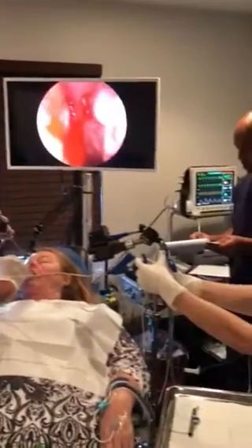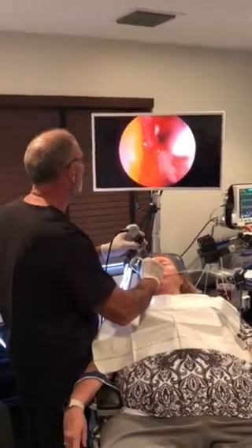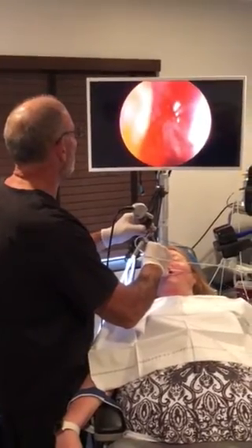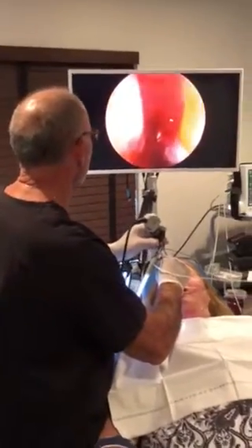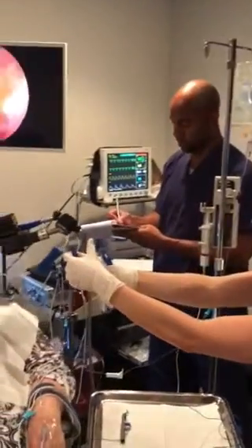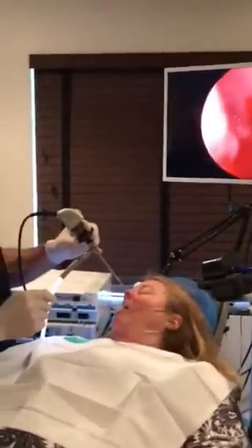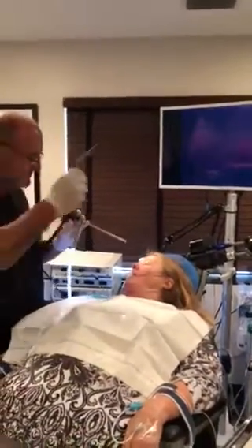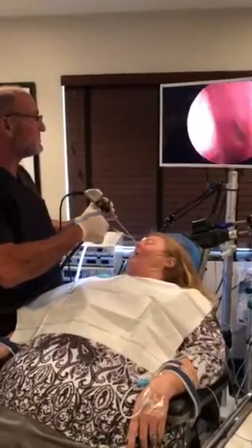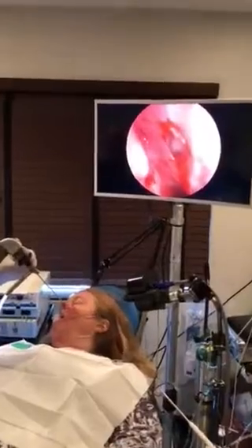Deflate the balloon. We're right where we need to be. You can see the opening that we're making in that maxillary sinus already. Inflate the balloon, then deflate. Very good. Come on out. And you see very clearly the nice opening that we've made in her sinus. We can do several of the sinuses this same way, and we'll keep proceeding with this case and moving right along.